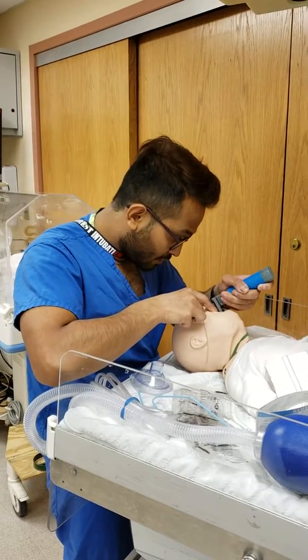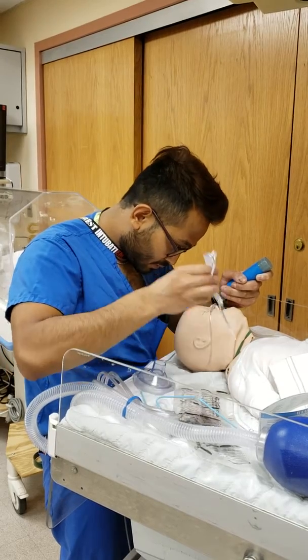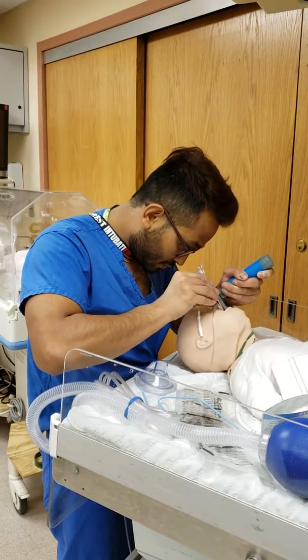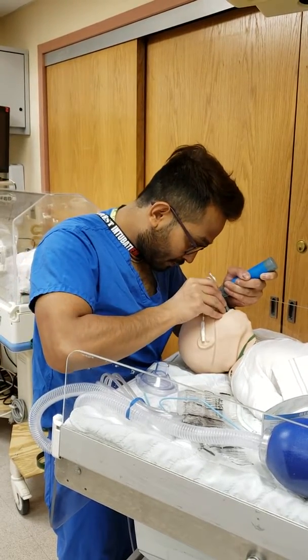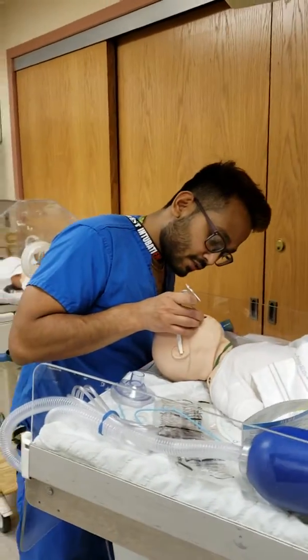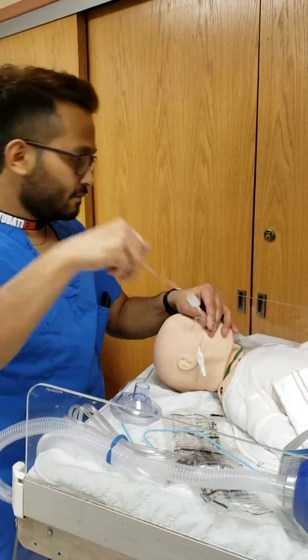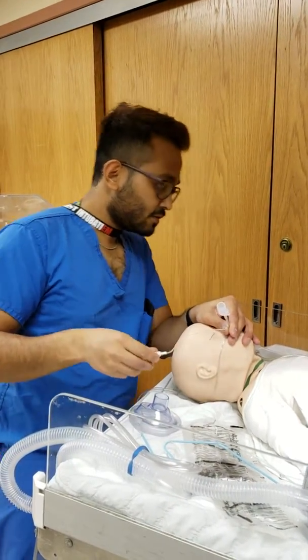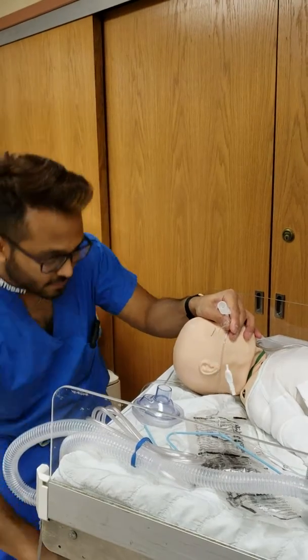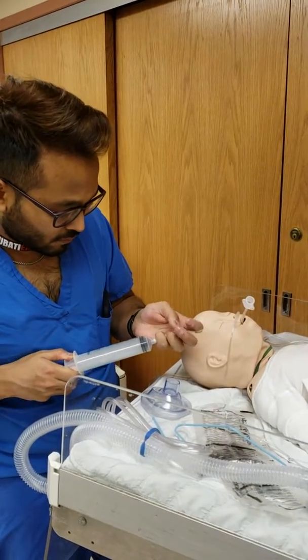Got the tube ready? The lip line is supposed to be at 10 or 11 — I'm at 11. Another advantage of the cuffed tube is when you inflate it, it stays in place. When it's uncuffed, it's very easy to dislodge. Almost in is almost out.